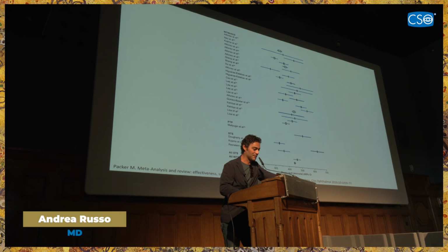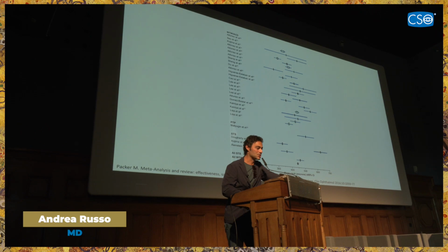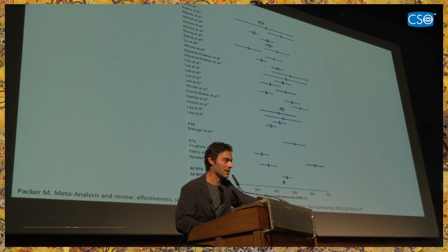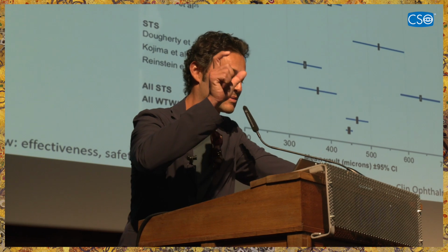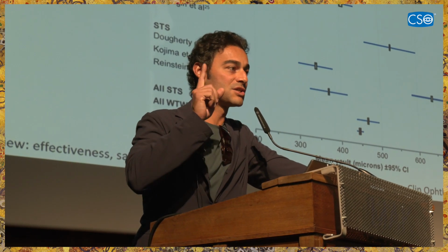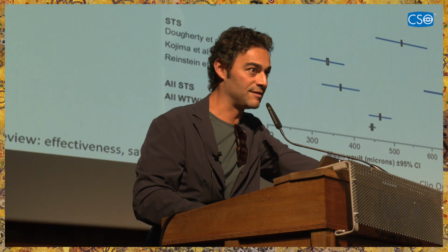we still play safe. So we have the formulas that are based on the white-to-white, we have the formulas that are based on the sulcus to sulcus, and nowadays we also have formulas based on the OCT, such as the Nakamura ones. But as you can see, there is this huge scattering, no matter if we consider the white-to-white or the sulcus to sulcus or whatever, such as the distance between the scleral spurs, because the white-to-white is only a proxy for the sulcus, and the sulcus itself is only a proxy for the final destination of the lens, which is actually very difficult to predict. I will show you what I mean.